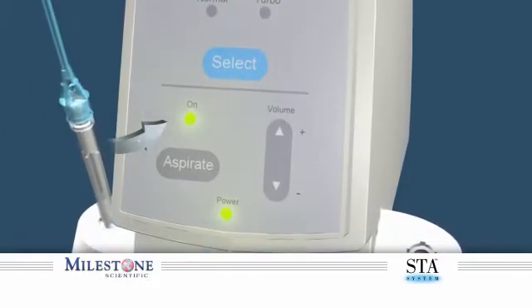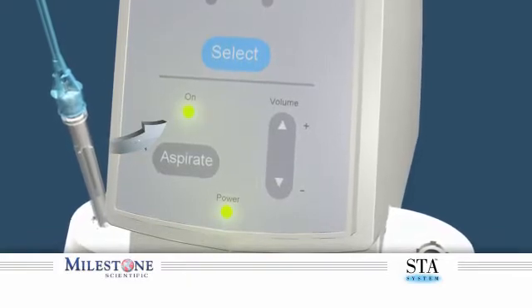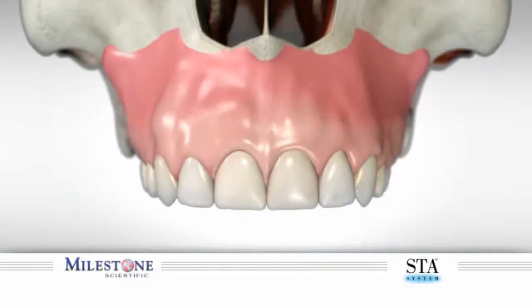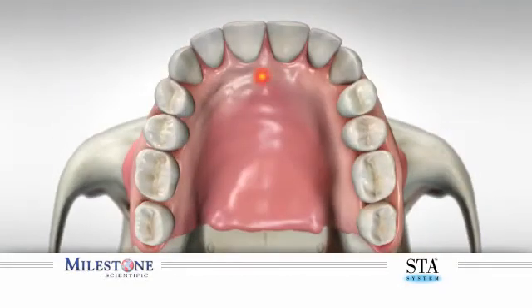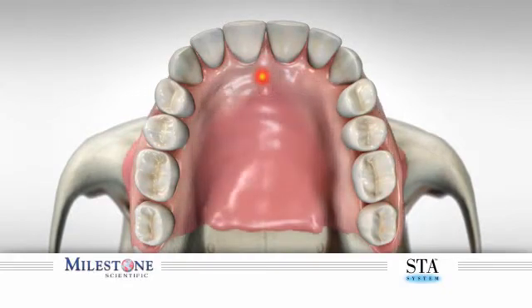Make certain the aspiration feature is on, as an aspiration test may be performed during the anesthetic delivery. This injection is initiated just lateral to the incisive papilla along the incisive groove while targeting the underlying nasopalatine canal. The objective is to gain entrance into the canal and maintain contact with the inner surface of the bony wall of the incisive canal.